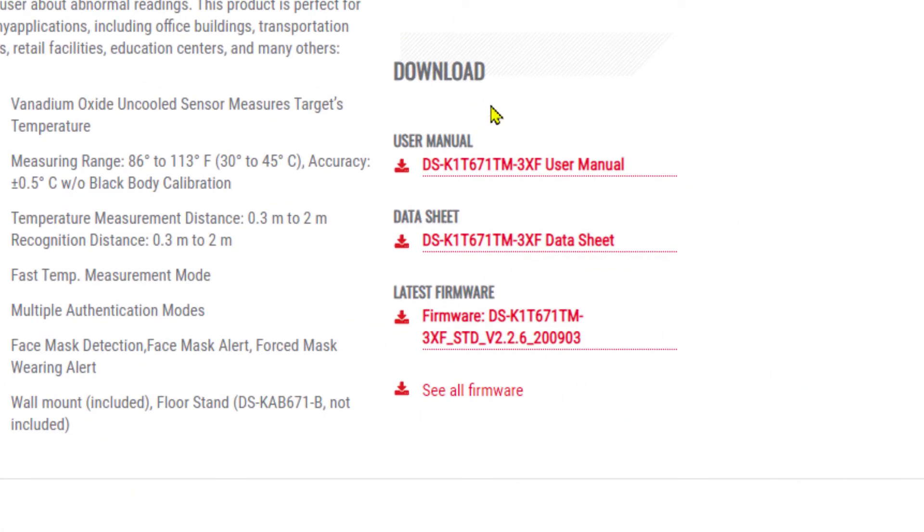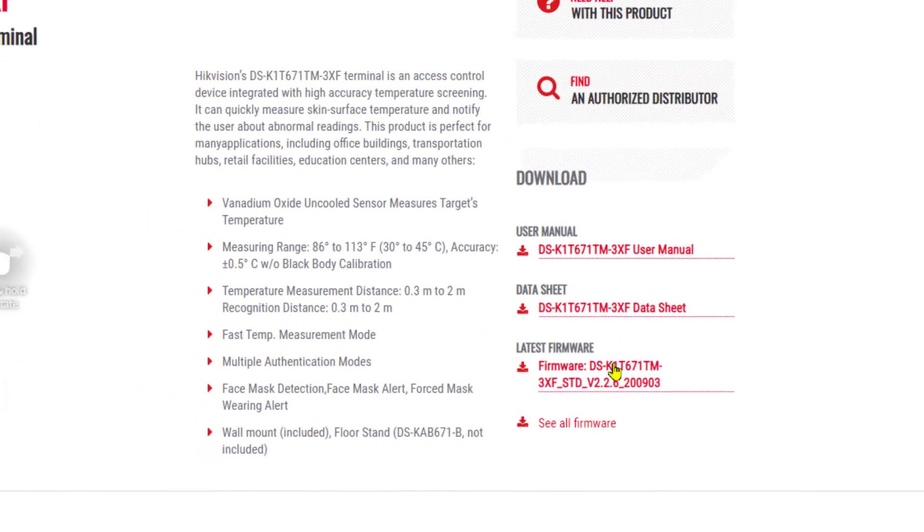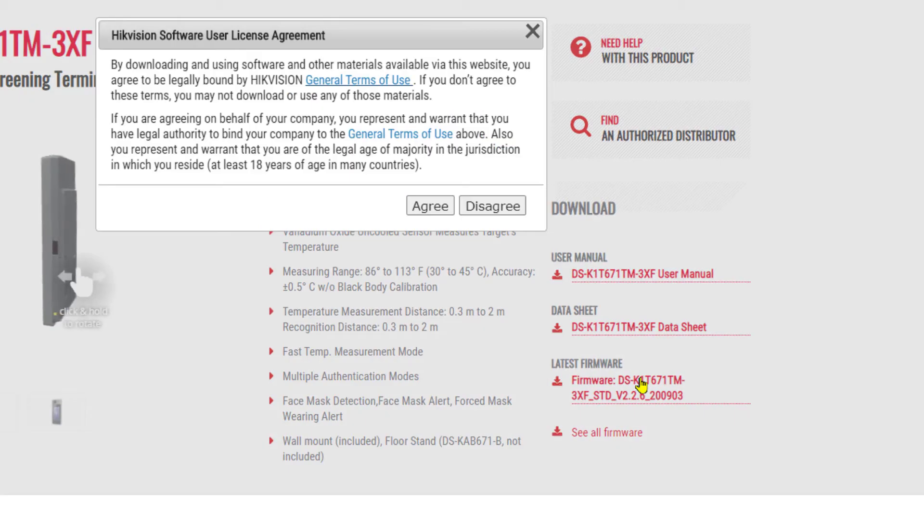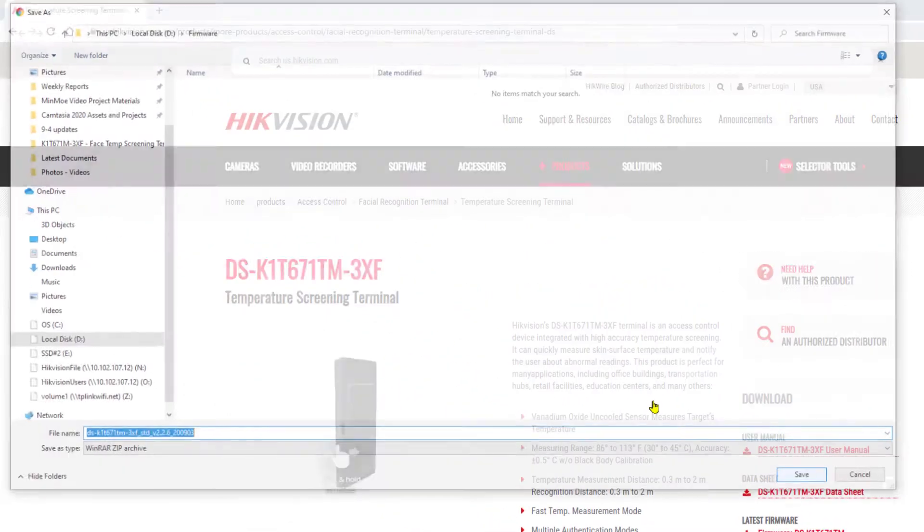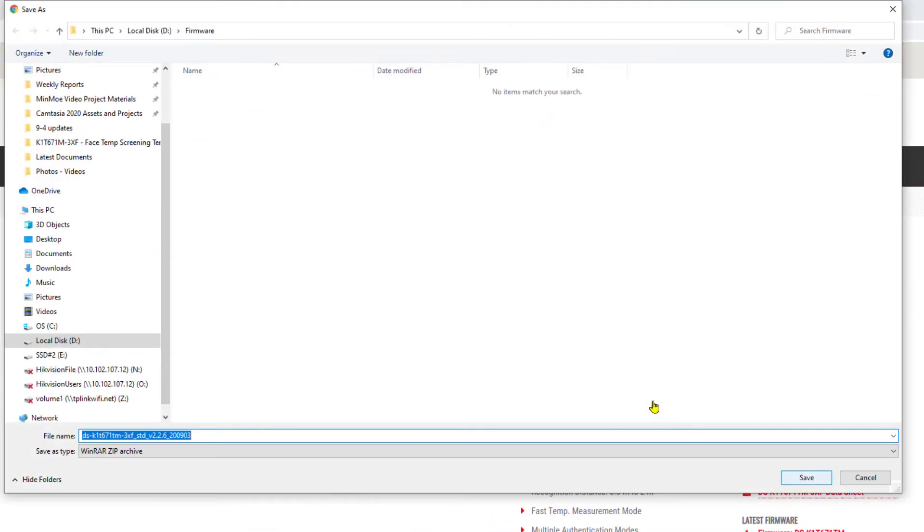I'm going to select it and here's my download section. I can get the latest user manual, the data sheet, and here we have the latest firmware. I want to go ahead and select this, agree, and start the download process.